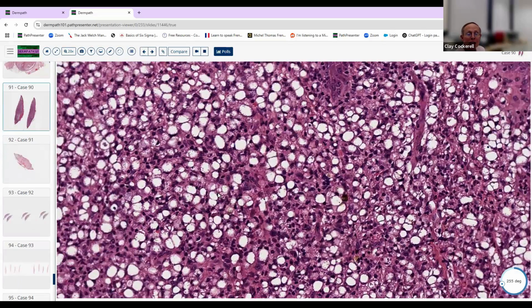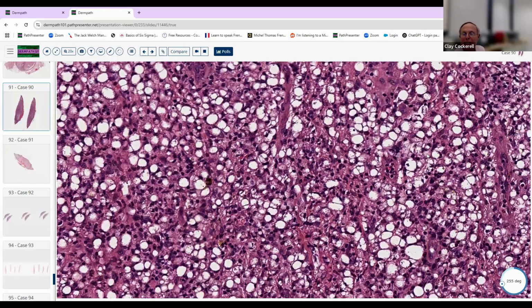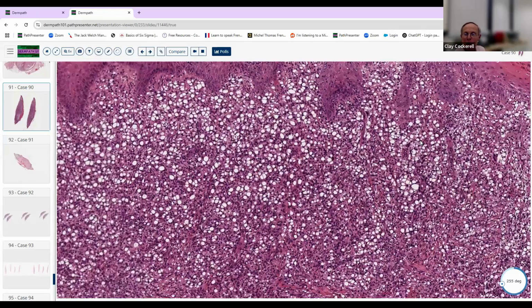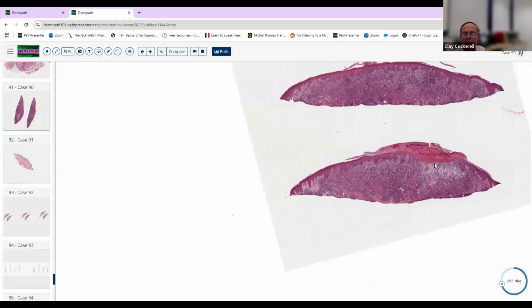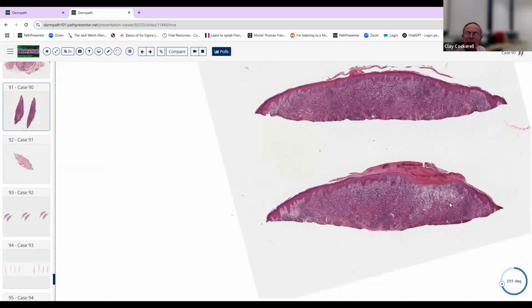We've got all these cells that have these marquee signs in them. These are histiocytes. Pale equals histiocyte, filled with organisms. Leishmania. This pattern, if you see the low magnification, pale plus dark beneath, think Leishmania.